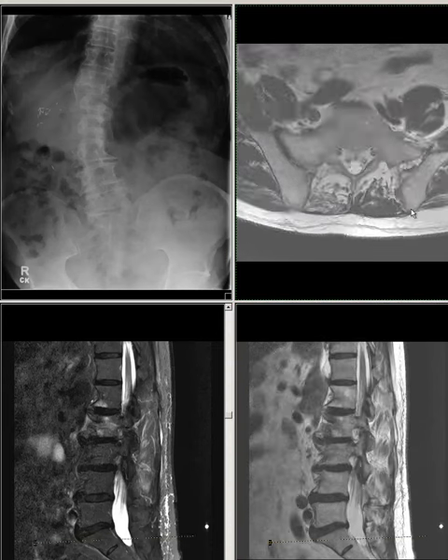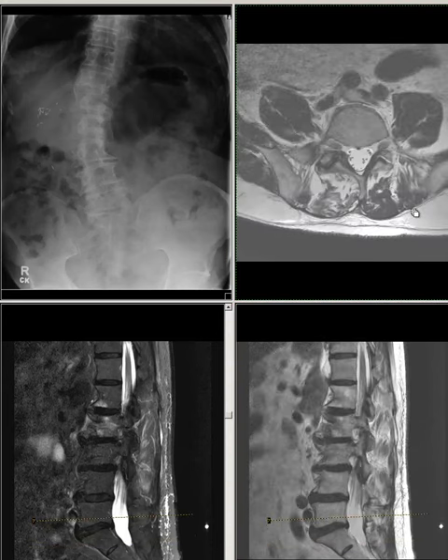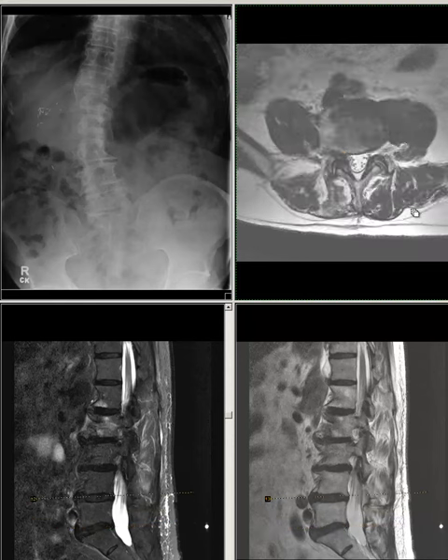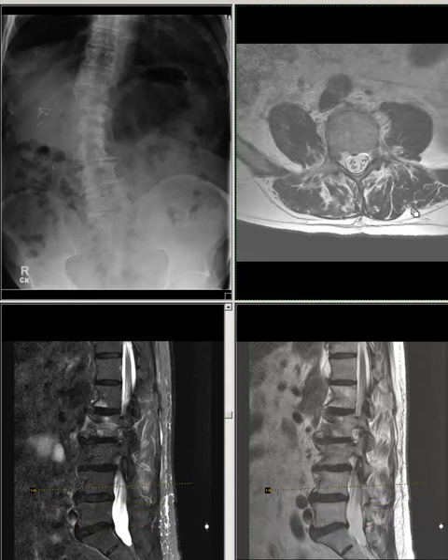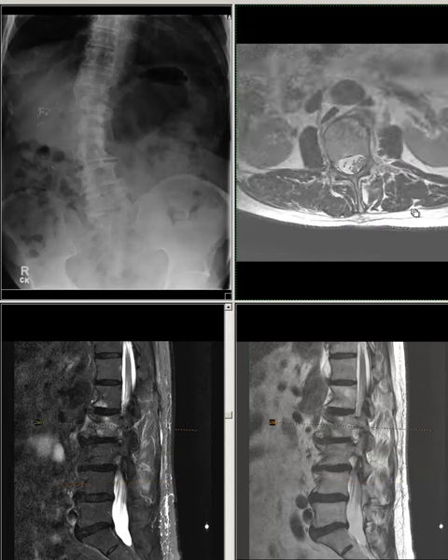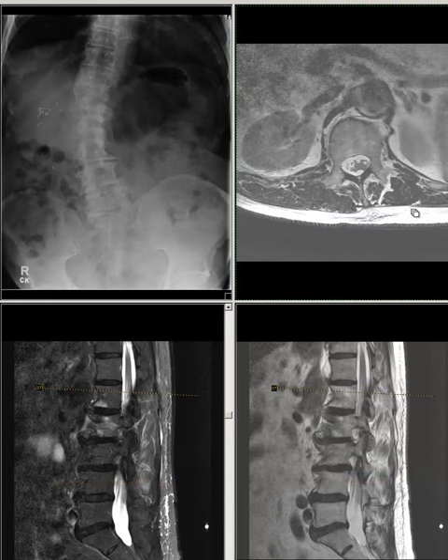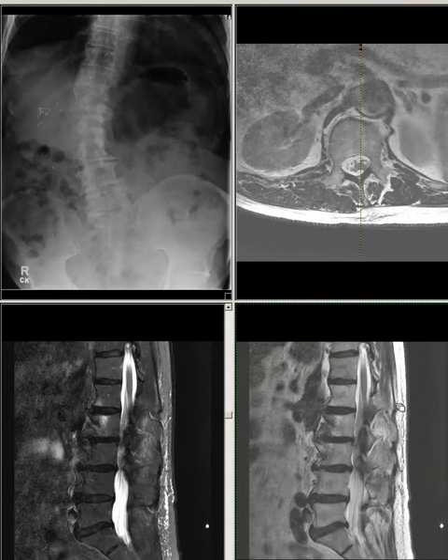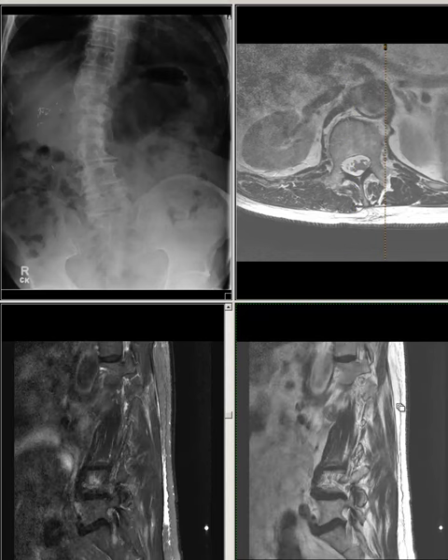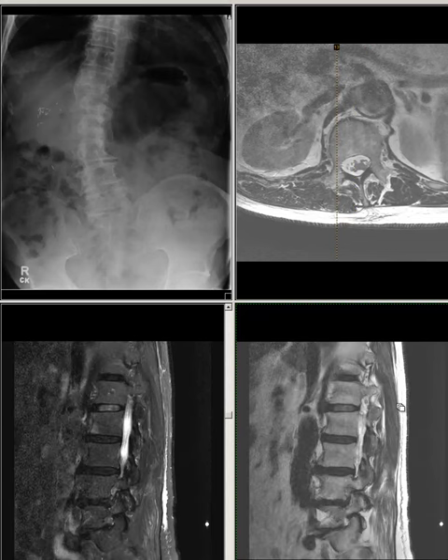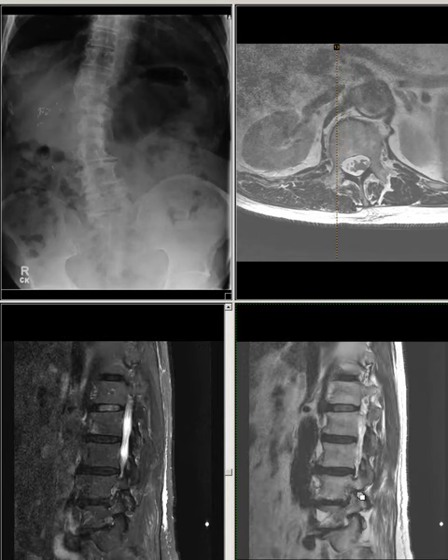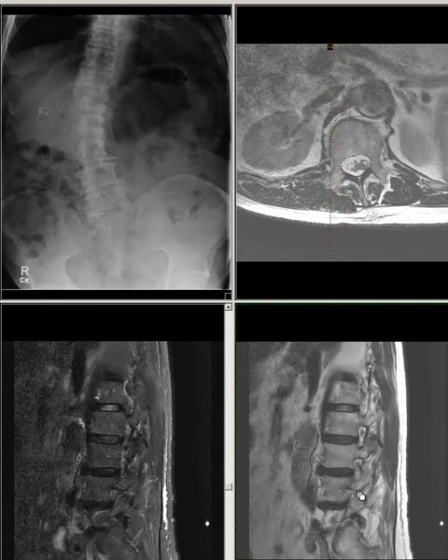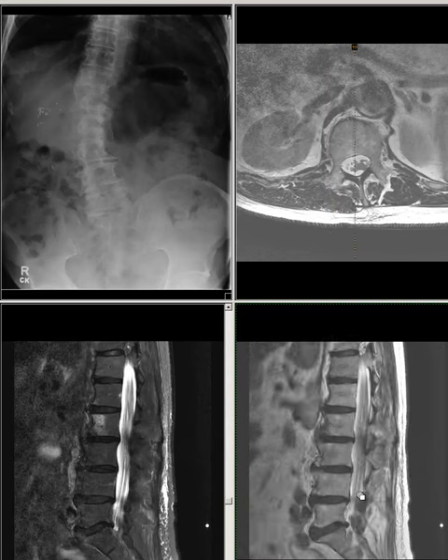Impression: Dextroconvex rotatory scoliosis of the upper lumbar spine with multi-level degenerative disc disease, as described. Neuroforaminal stenosis with probable nerve compression at L4-L5 and L5-S1 levels on the right side is noted.